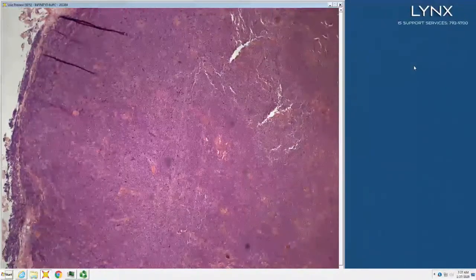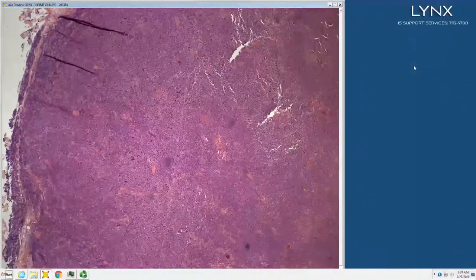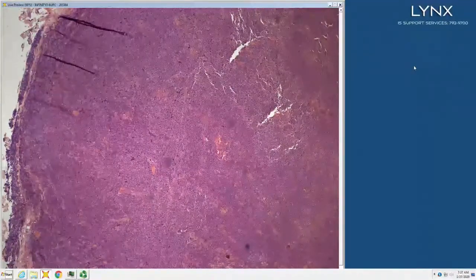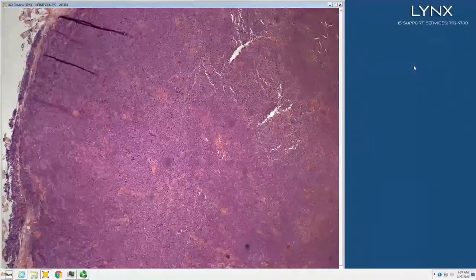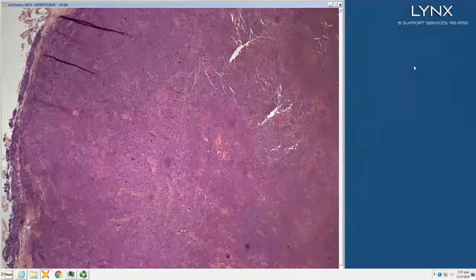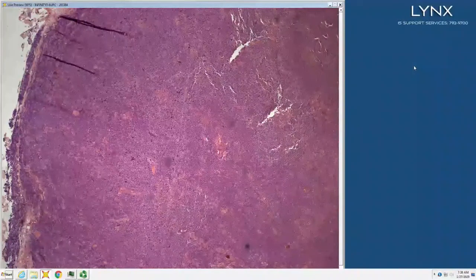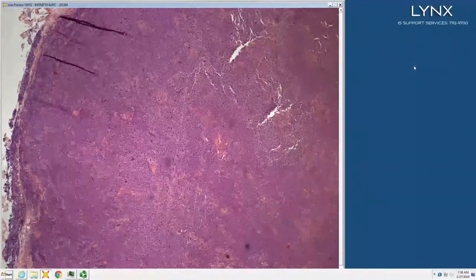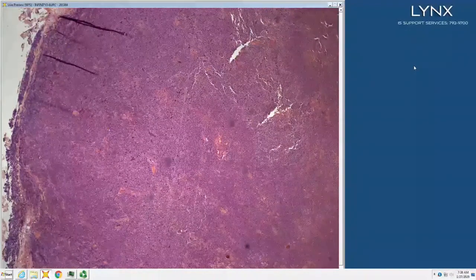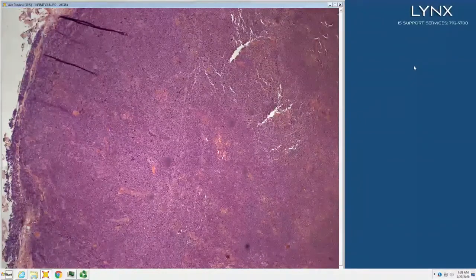There are other markers, PAX5 and others, that are also used as B cell markers. This one is BCL2 positive. What does that suggest? So marginal zone can do that, but it doesn't look like a marginal zone. It's a big diffuse lymphoma. So that could be 20% of primary cutaneous, but the rest are systemic lymphomas. And this one proved to be a systemic lymphoma.